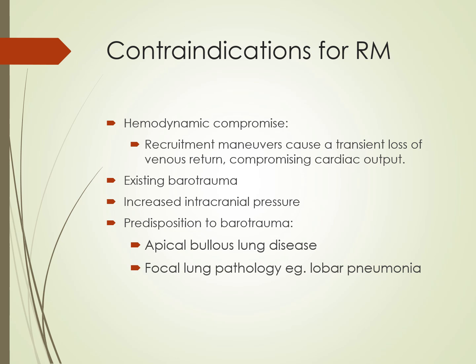So basically, you need to be hemodynamically stable. If you have any kind of existing barotrauma, like a chest tube, that is contraindicated. Increased intracranial pressure is another contraindication. Or if you have any kind of bullous lung disease or any kind of focal lung pathology, such as a lobar pneumonia. All of these are contraindications to the use of a recruitment maneuver.